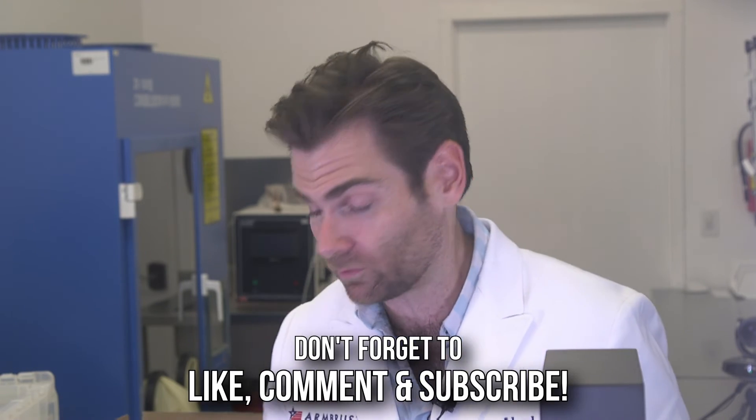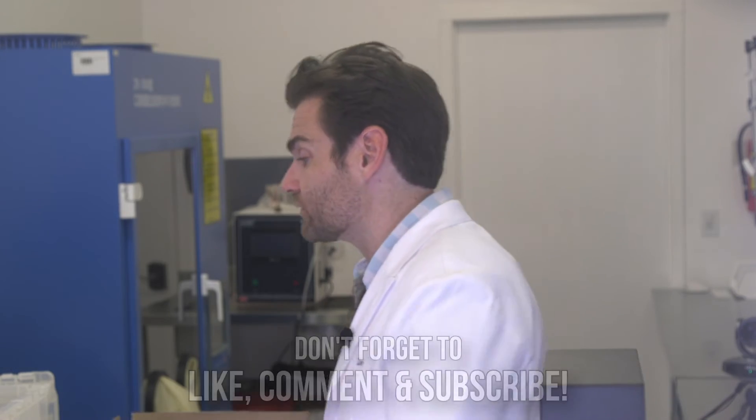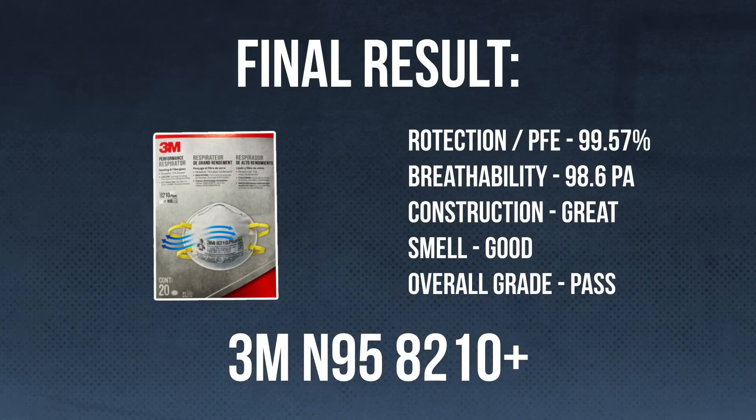So glad we finally got to test that one — it's a good mask. The only thing I don't like about 3M is that they invented most of the mask technology, but they seem to care more about quarterly profits over actually protecting American citizens.